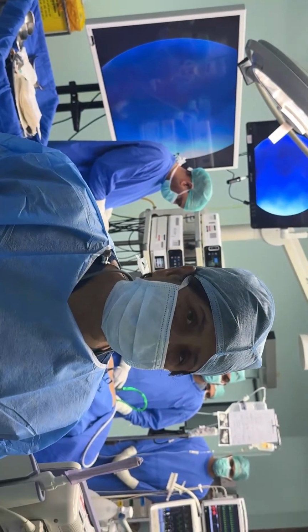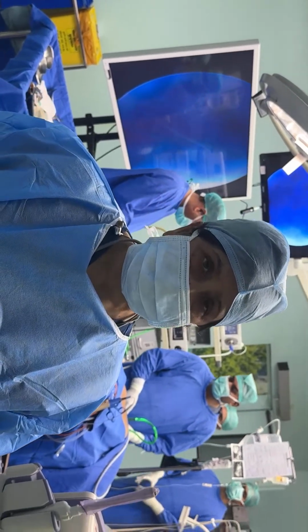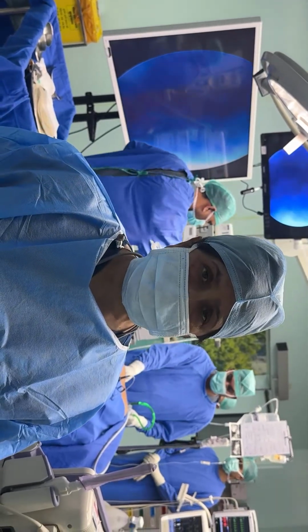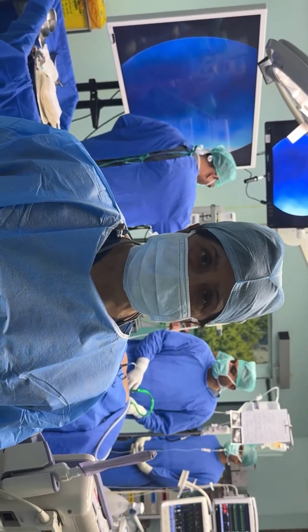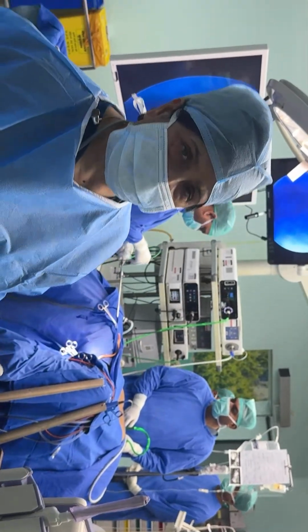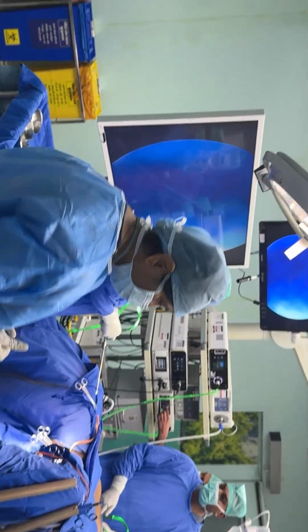So good morning. Today we are going to show a case which is a very early Cesarean Scar Ectopic Pregnancy. A 35-year-old female, married for 2.5 years, and the last cesarean was done about 1 year back with a transverse cesarean scar. So today we will first start with doing the ultrasound in the theatre. Gloves.